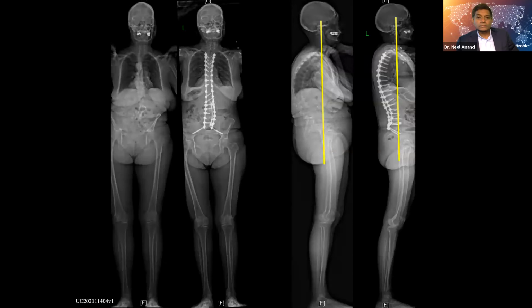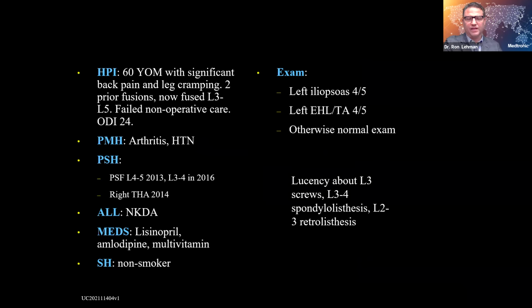Sagittal plane profile, I think we improved this quite a bit as well. And certainly when we look at that, we maintain some harmonious balance of the thoracic kyphosis, the lumbar lordosis, and her gravity line we once again put in place and really make sure that ultimately we balance her. And then once again, this is all from a posterior approach, all of something that we know how to do. And the question really is ultimately, how do we achieve our correction when we look at this comparatively?